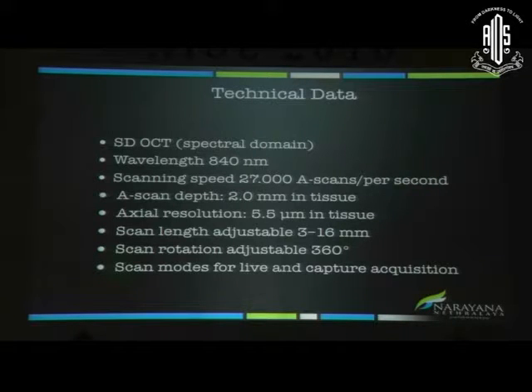The surgeon can actually select the scan length, the angle and the location either by using the foot pedal control or through a video monitor display system that there is. You can have both live and a capture acquisition with this device.